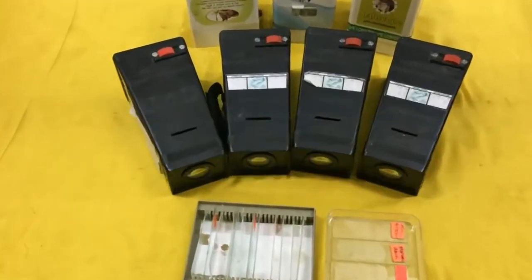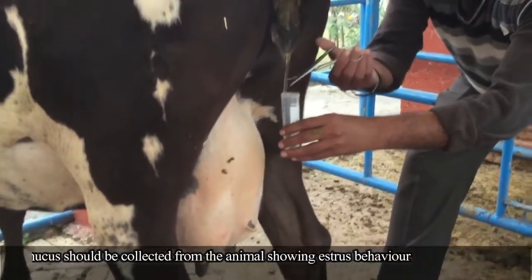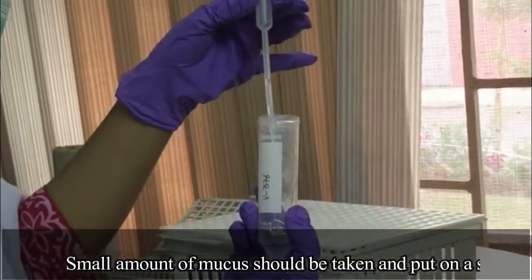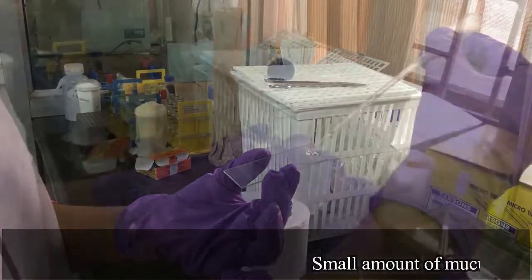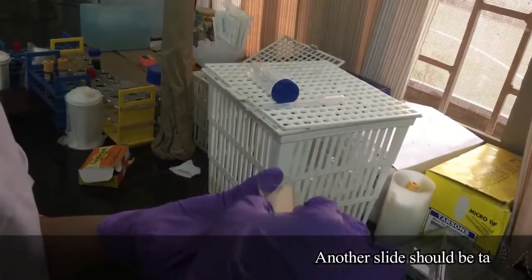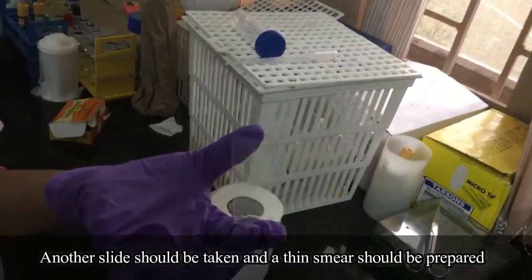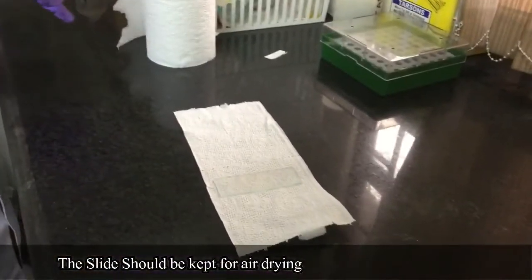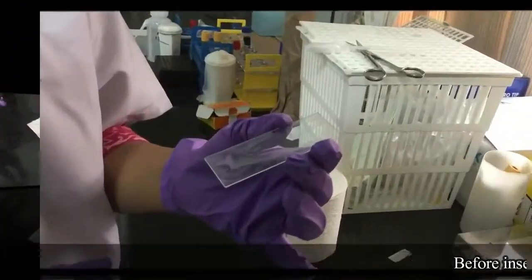Procedure: Cervical mucus should be collected from the animal showing estrus behavior. Two clean glass slides should be taken. A small amount of mucus should be put on a slide, then another slide should be used to prepare a thin smear. The slide should be kept for air drying, and after the smear gets dry, it should be taken to see through the CrystalScope.